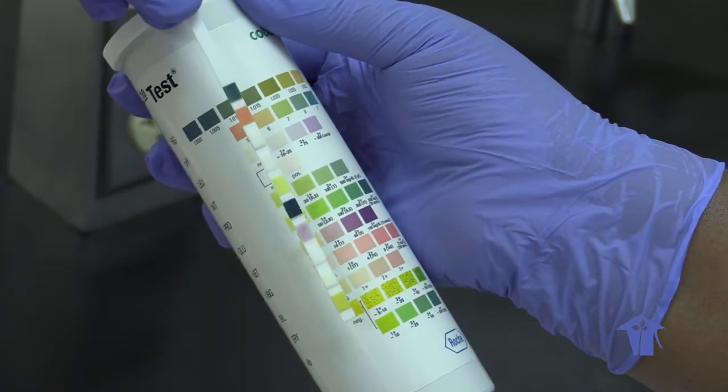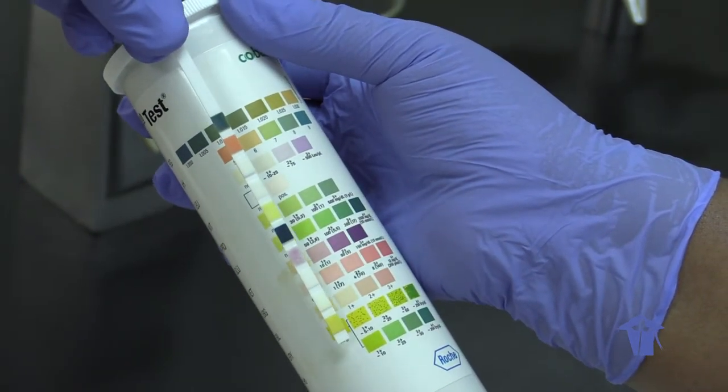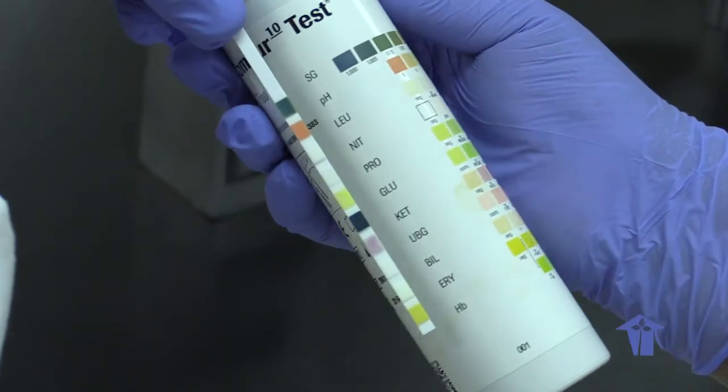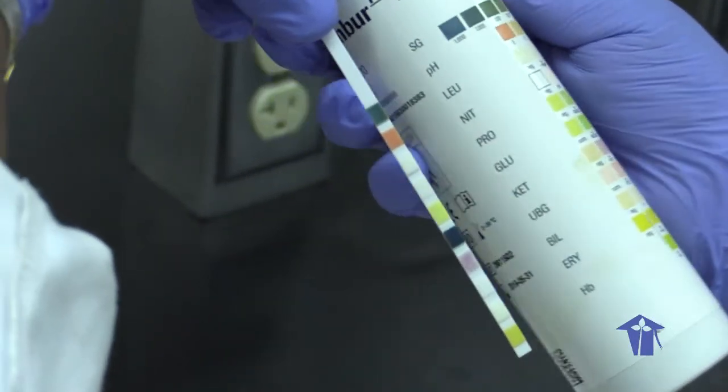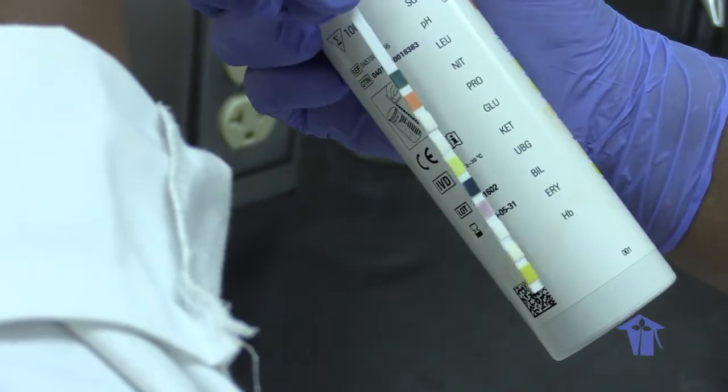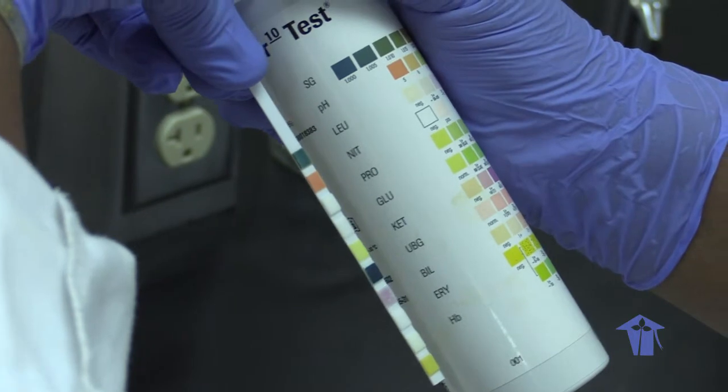And the ketones, which is your purple color, it's about 1 plus. So this is an abnormal urine. So this person is releasing ketones and glucose in the urine.